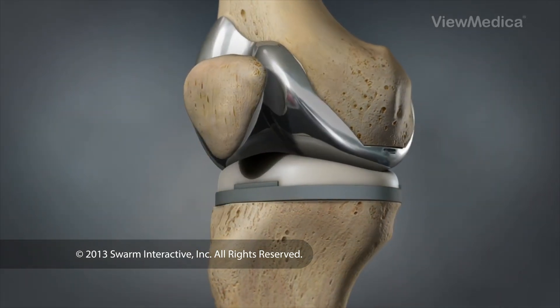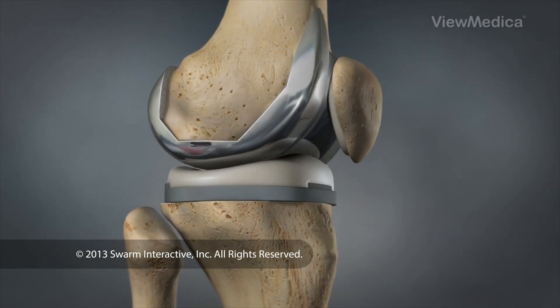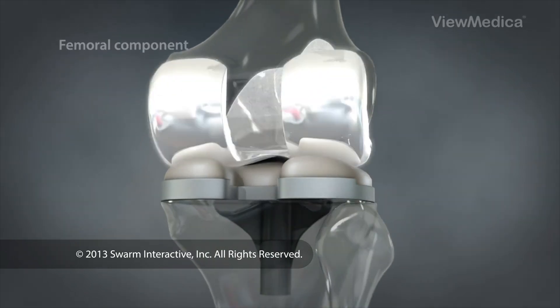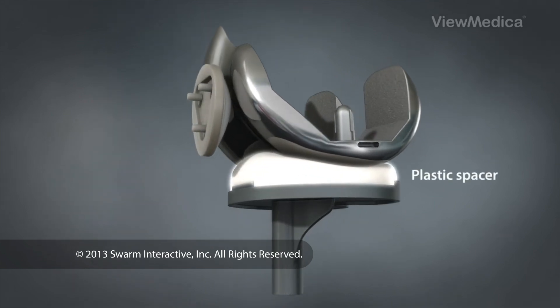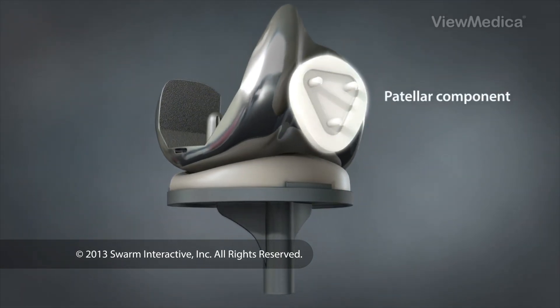During the procedure, the surgeon replaces the damaged portions of the knee with artificial parts. These parts consist of a metal femoral component, a metal tibial component, and a plastic spacer. A small plastic patellar component may also be used.